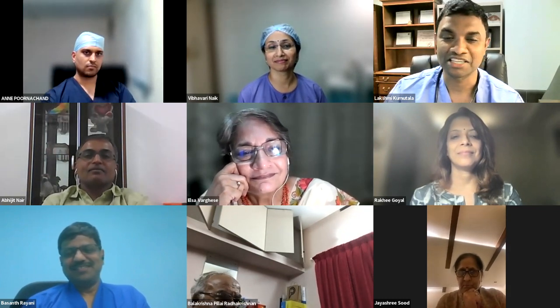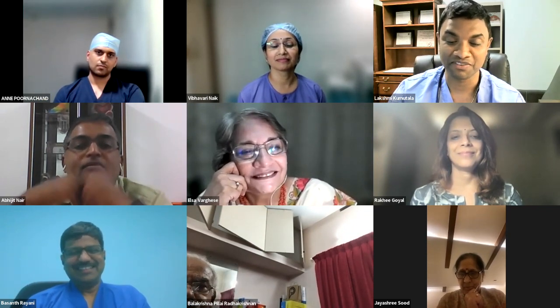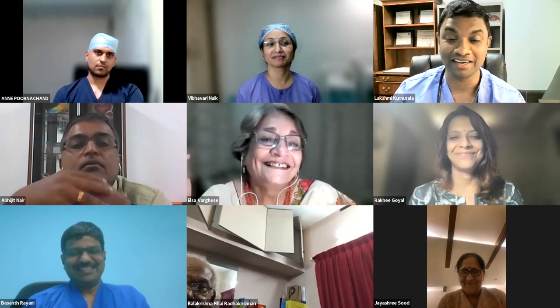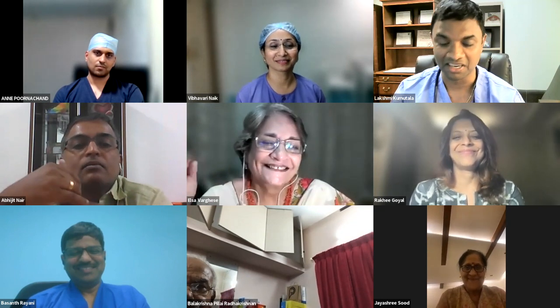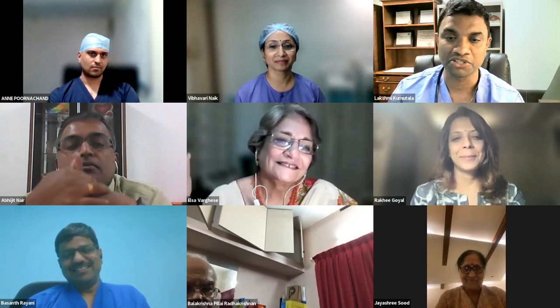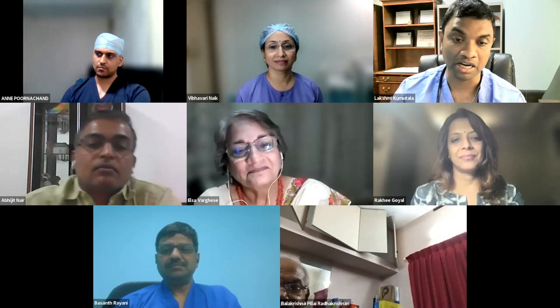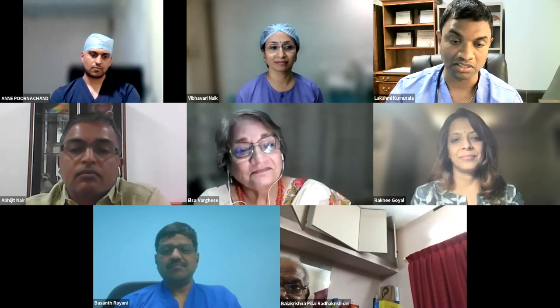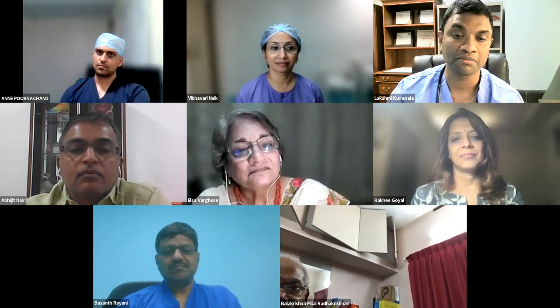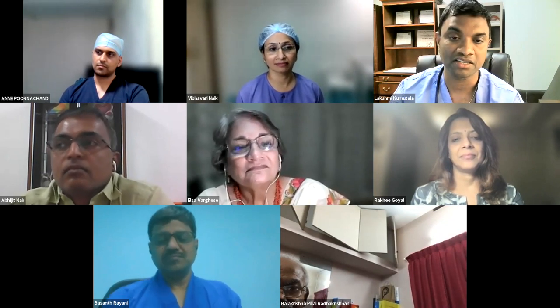It happened to me, Dr. Elsa, many times. The surgeon actually told me, you need to give 20 milligrams of rocuronium. I gave 2 cc of saline because I don't have any twitches for this patient. And the surgeon said, "Oh, very good, excellent, everything happened." So for our rationale for using the muscle relaxant, we cannot have fixed rules here. We have to go case by case, depending on the availability of the medication and of neuromuscular monitoring. It can be the cost, the onset of the medication, the duration of the medication, and patient factors like any systemic diseases.